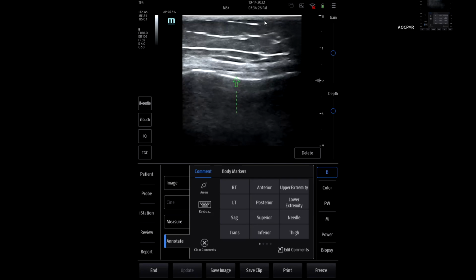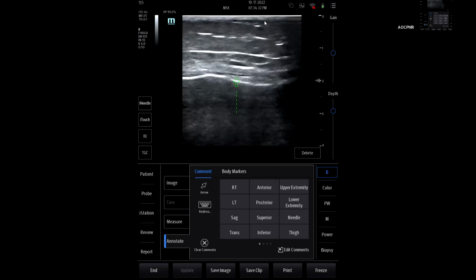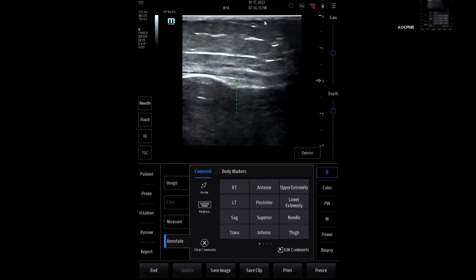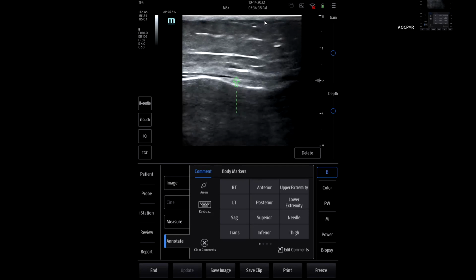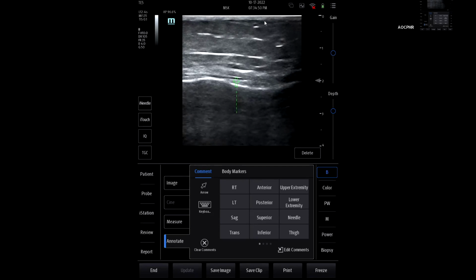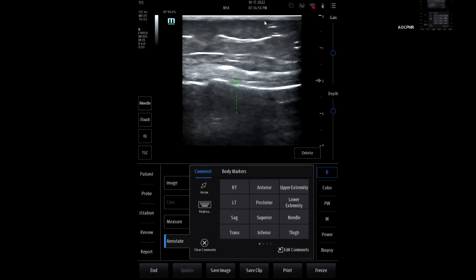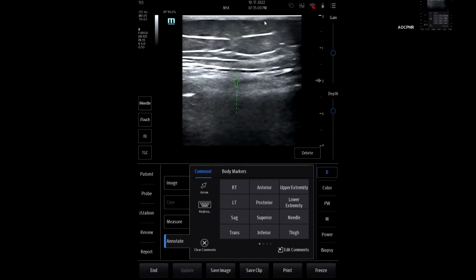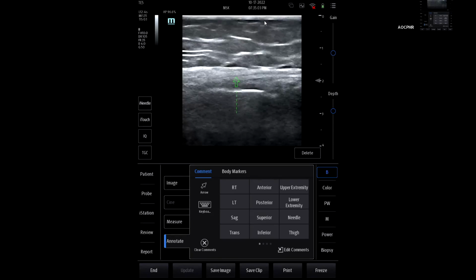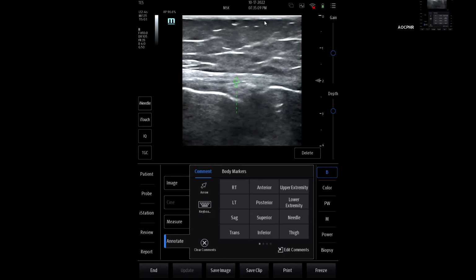You can see the difference. You see that line, I'm going to put the arrow right on it. That arrow, seeing that black line going straight across, that's the difference between where the tendons attach to the pes anserine, the Sargent T, remember? Do you remember what they stand for? Semitendinosus, gracilis, and sartorius. So those guys are the ones that attach, and underneath is our MCL. When you see bursitis, you see it either in between or on top of that. But anyway, yours looks good, going up over top. Good tendon. Your meniscus is not extruded, thank goodness.